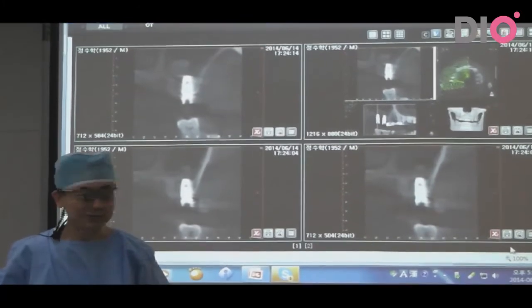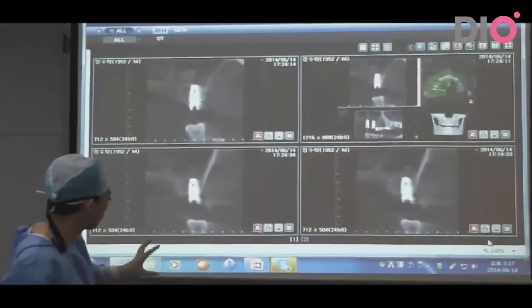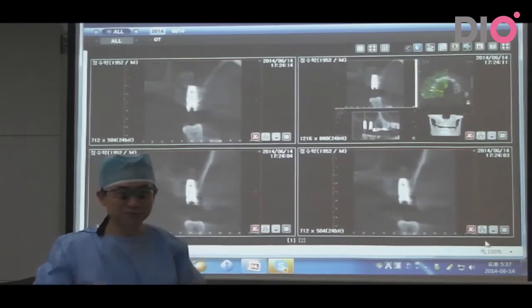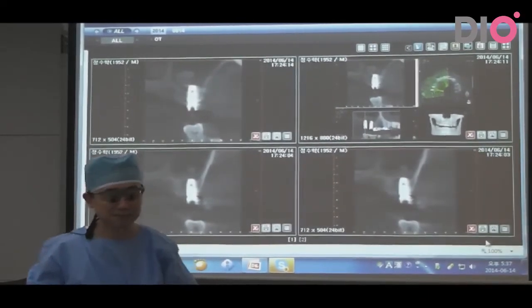I think the quality of this CT scan is not satisfying, but you can see the overall view of the graft material in the sinus cavity.